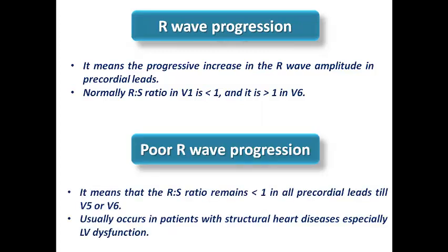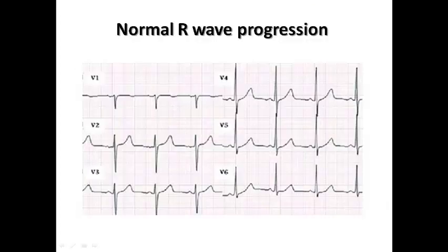We have another phenomenon called poor R-wave progression. The transition zone is delayed in this patient until V5 or V6, meaning the R-S ratio remains less than 1 in all precordial leads until V5 or V6. This usually occurs in patients with structural heart disease. Here we can see an example of normal R-wave progression in which the transition zone is at V4.